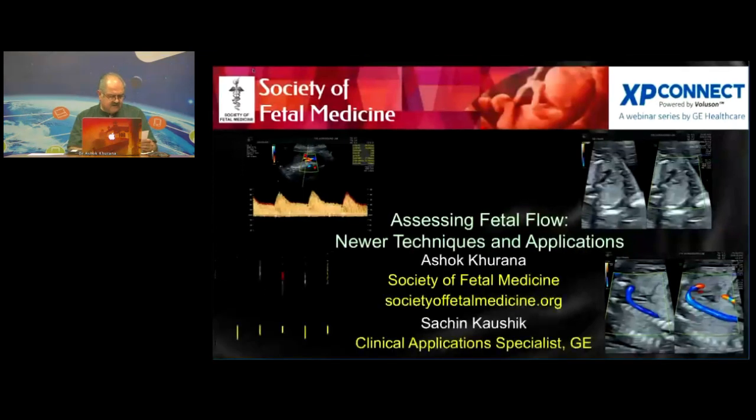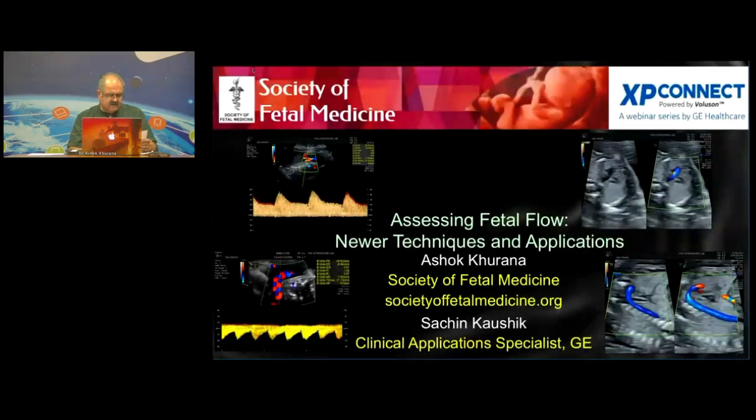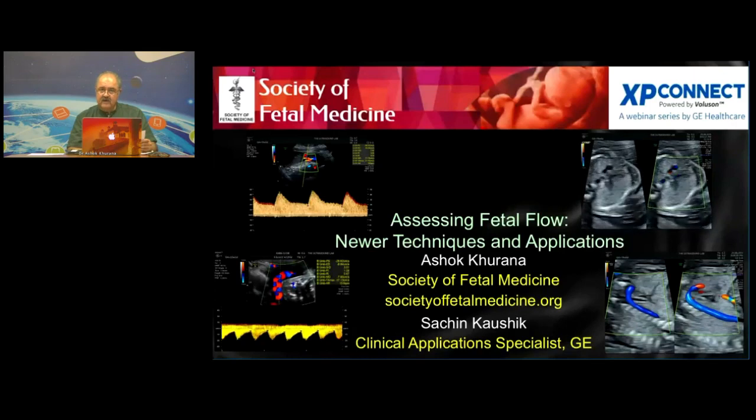There's a very interesting question. Till what gestation age should we report uterine artery PI? We should report it from 11 weeks to 41 weeks. From 11 weeks to 41 weeks, we must report this. That is extremely important because it is relevant all the way to the end.